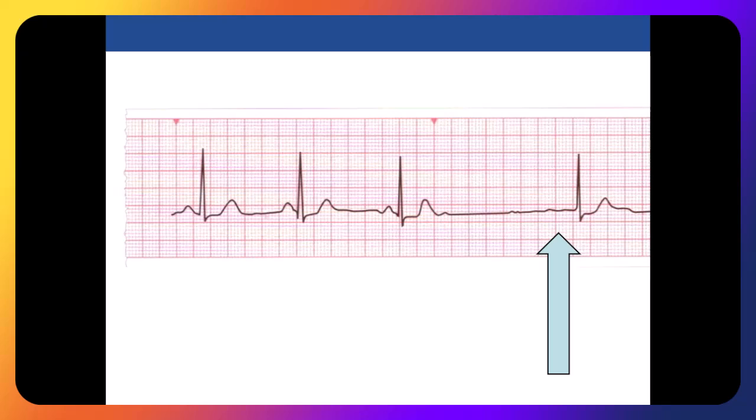So are you talking about right in there? No. Because if that's a P wave, now what are we thinking about? Probably not. And the reason being is that this would not be a junctional, because when you have a junctional escape beat, you're either going to have a PR interval that you can't measure, or it's going to be shorter than normal.